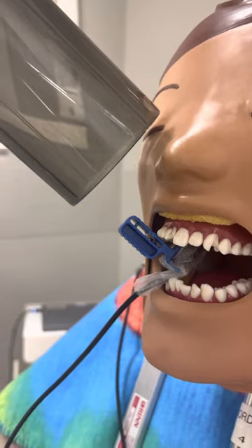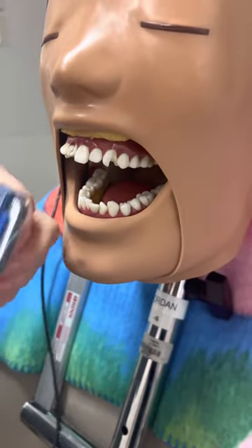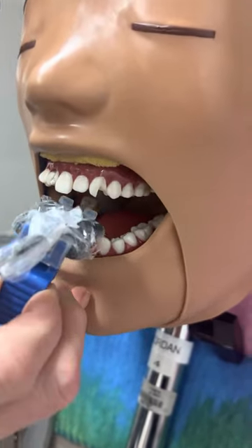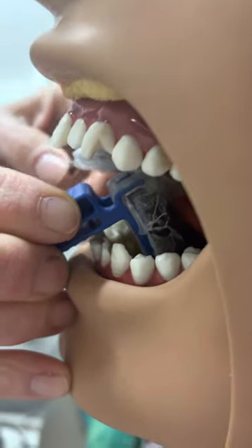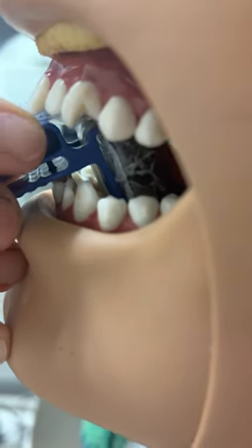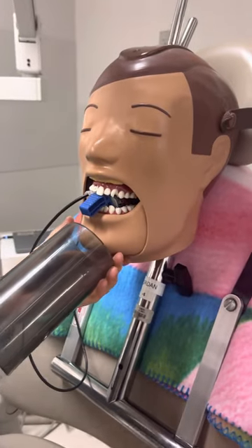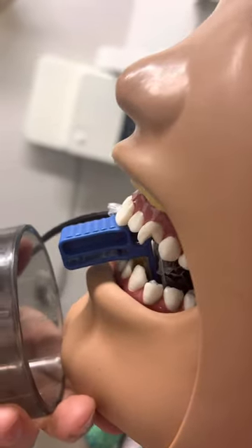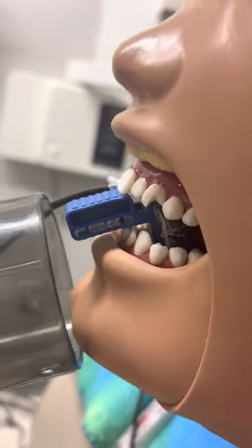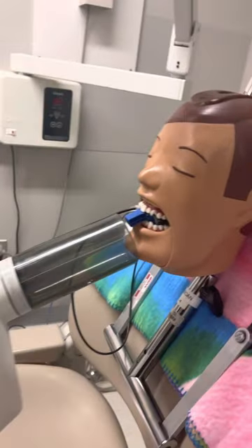That's the maxillary. Now let's do the mandibular centrals. When you do the mandibulars, you have to make sure there is a part of the sensor that is above the incisal edge of the teeth. You want it above the teeth a little bit — not down in there too far. The patient's going to bite just to hold it. Now we're coming with our angle — a lot more angle than we used with the XCP. You can see the line of where her sensor is to her cone.